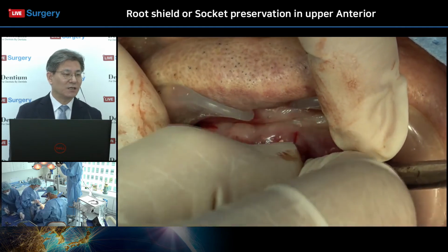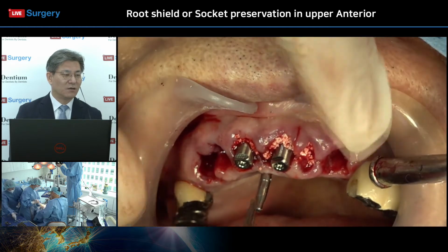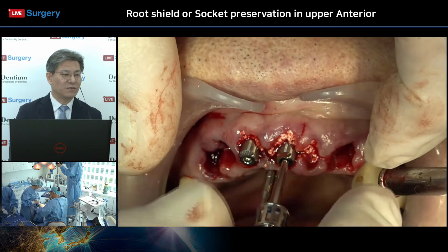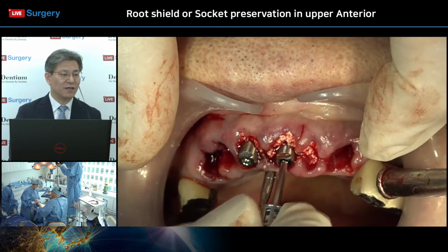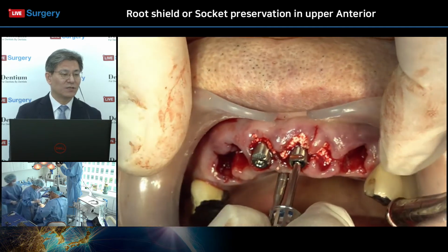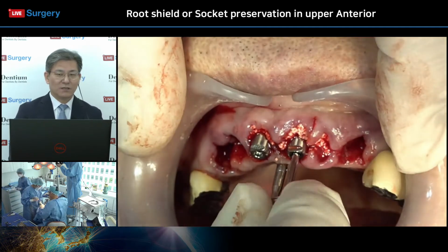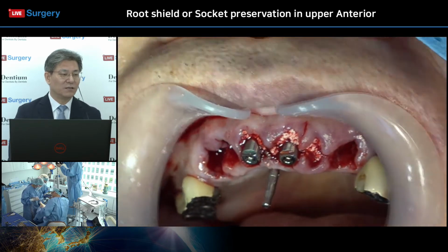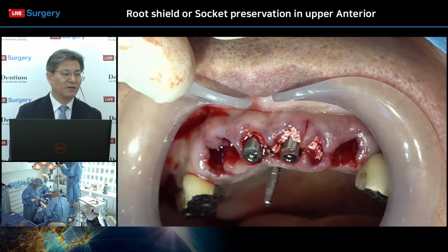Especially, scanning and stitching seem fine at this level. Upper anterior area, because this area is aesthetic. Is it okay? So the aesthetic part is important, as you know. It's a bit weak, so scan comfort cap, stable, connect. This one is the scan comfort cap.